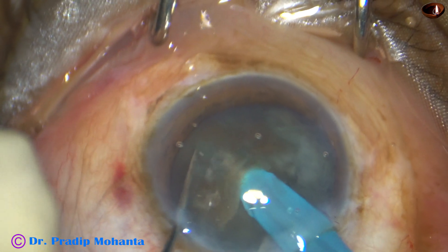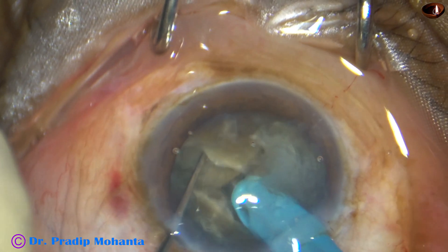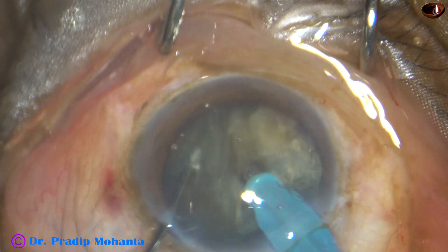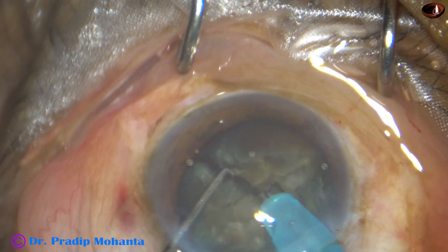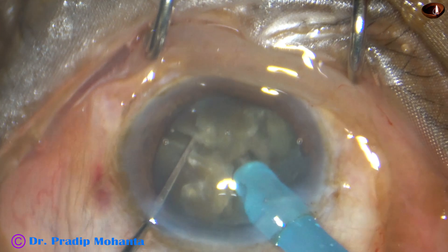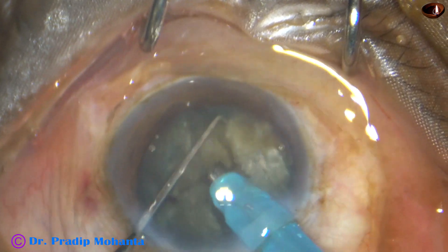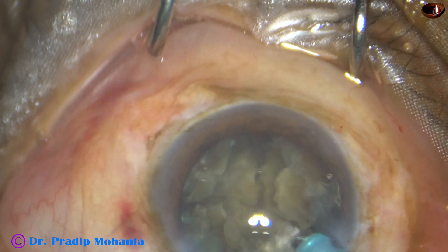This is another chop on this heminucleus. I came to the first crack and tried to separate the nucleus, but I could not. The two heminuclei could not be separated completely, and no fragment is free in this case. So I am sculpting a bit at the center and tried again, but was not successful in making the fragments free.